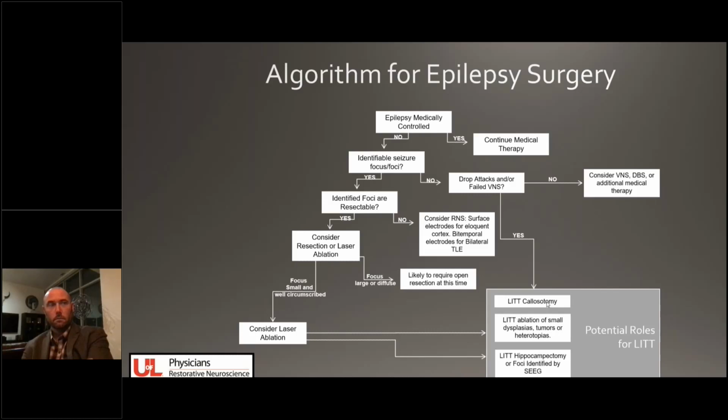He went from having multiple daily seizures to having no seizures for a period of about 18 months. But in the last 18 months, he has begun to have periodic seizures. And so our plan is to go back and laser the remainder of that corpus callosum, which is often done when you do an open callosotomy. If you do the anterior 2/3, you find yourself sometimes going to take the remainder.